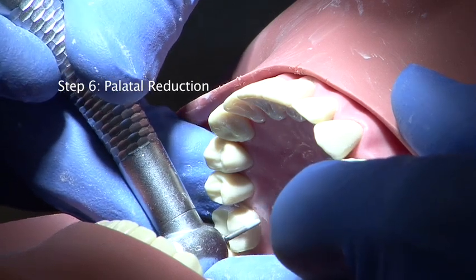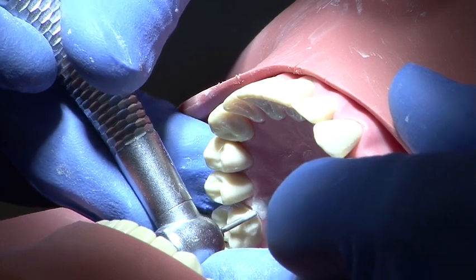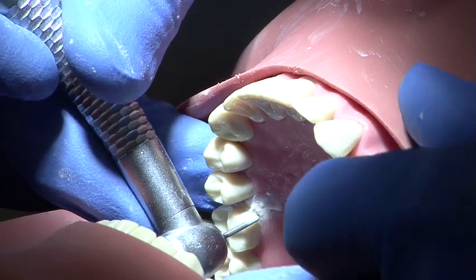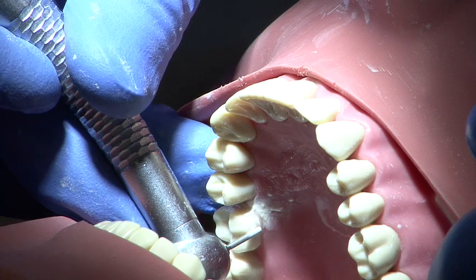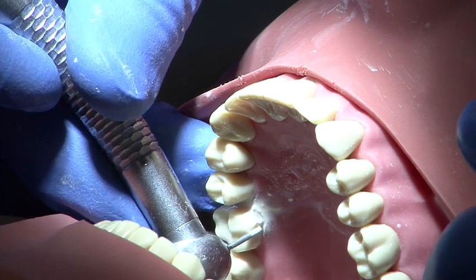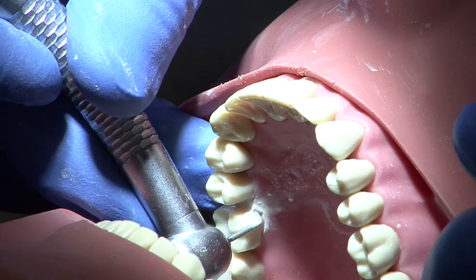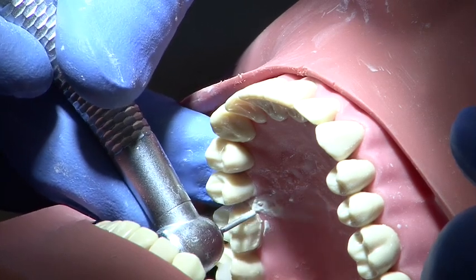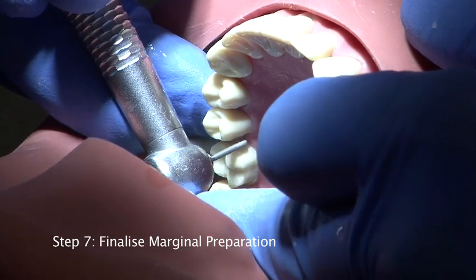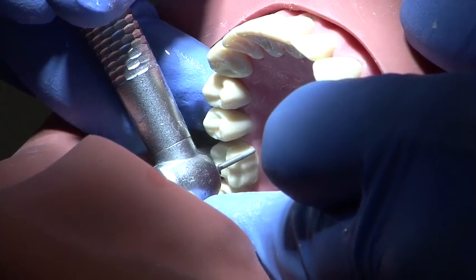This is repeated on the palatal surface with a chamfer margin, but only a single plane is employed because of the pre-existing functional cusp bevel. After all the margins have been prepared, check them for smoothness and refine using a fine grit burr.